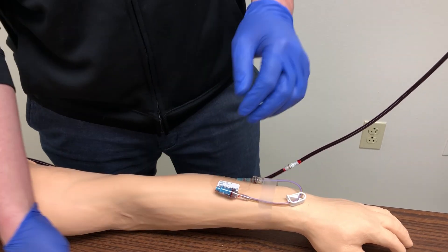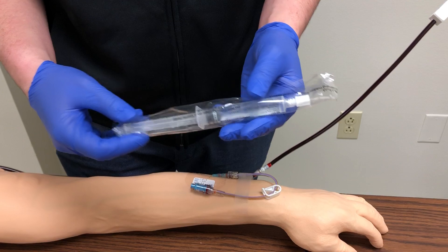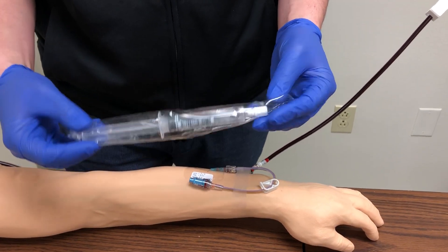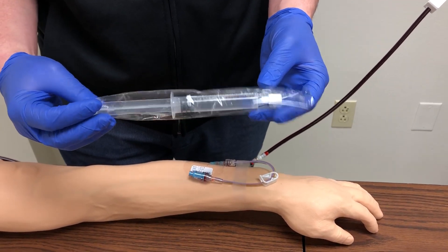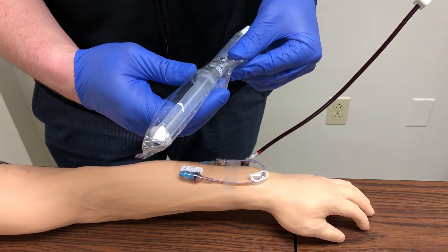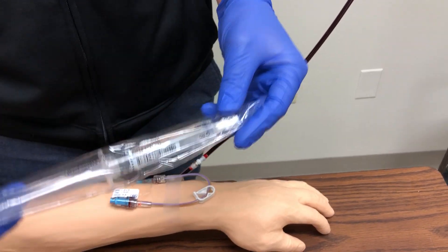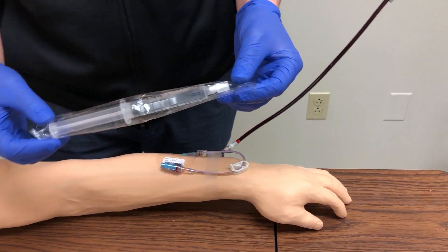First thing we're going to want to do is check the order — make sure we have a physician's order to saline flush an IV. Then we want to look at the packaging and check for the expiration date, which will be on the syringe. Once we know that the expiration date is okay, we can go ahead and perform our flush.